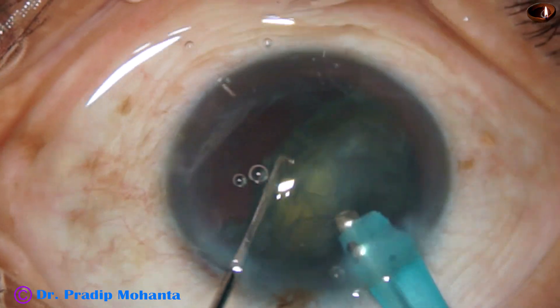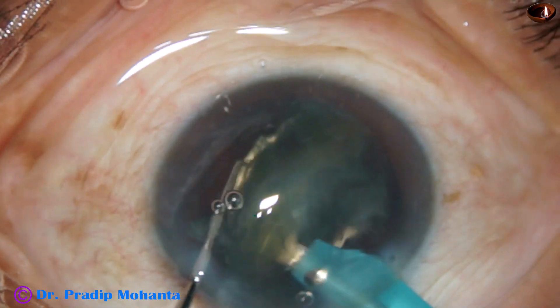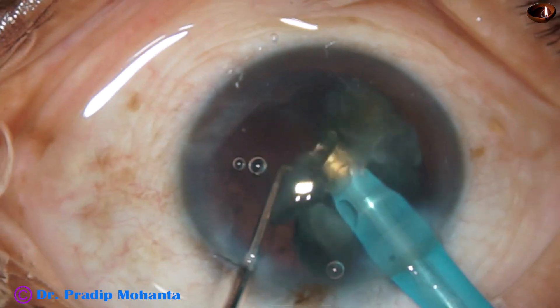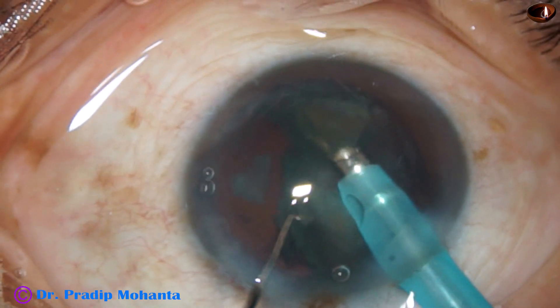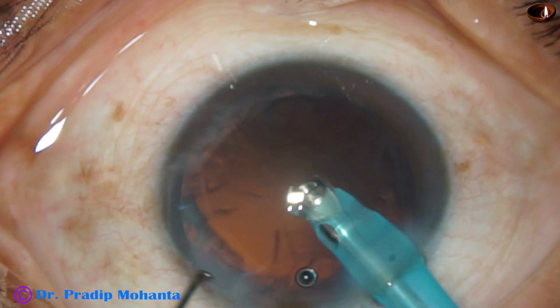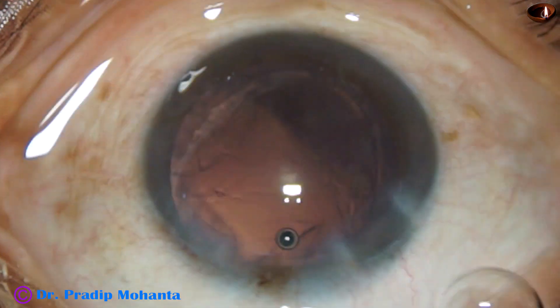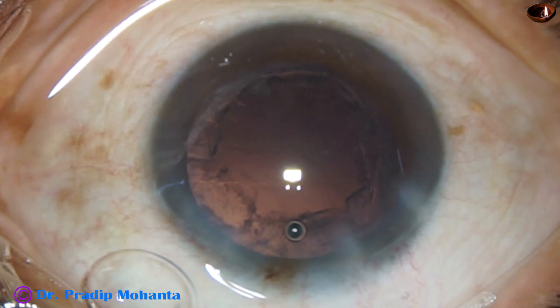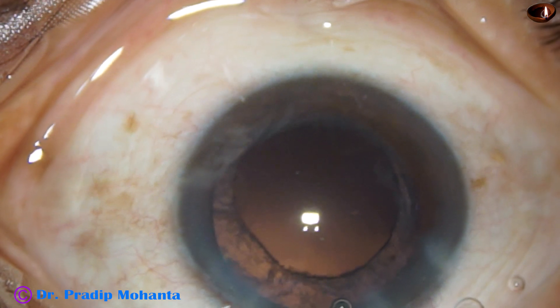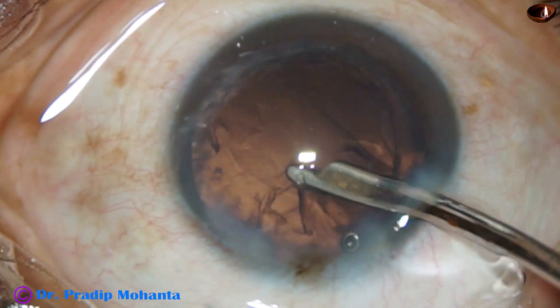In tilted position, I start eating off the lens mass. I find that though the nucleus is soft, the fibres are sticky. However, in tilted position of the lens, any soft cataract can be managed safely without any risk of posterior capsular rent. The tip of the phaco handpiece must be kept always at the iris plane, and there must be a space between the corneal endothelium and the phaco handpiece.